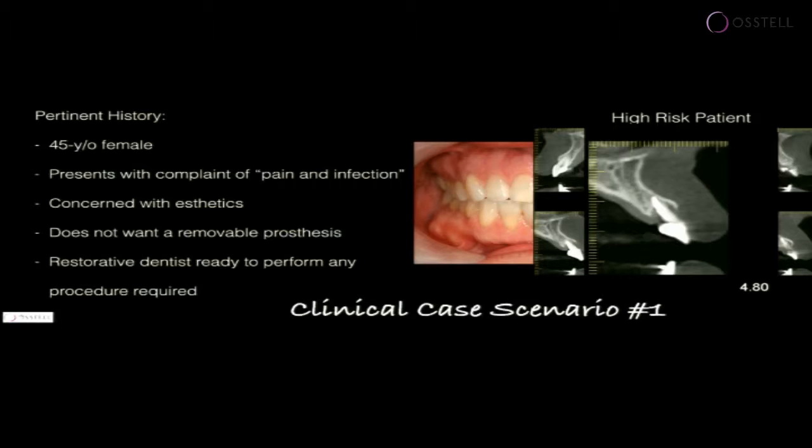Scott, would you? Yeah, if you take a look at the cross-sectional image that you're seeing here, it tells a completely different story from what you saw in the clinical photograph. And that is, of course, what I've termed in the literature the reality of anatomy. You see the tooth is at the trajectory going completely different from the trajectory of the bone. And as we start to evaluate the alveolus itself, we can identify the facial aspect of the cortical bone and the palate aspect of the cortical bone.